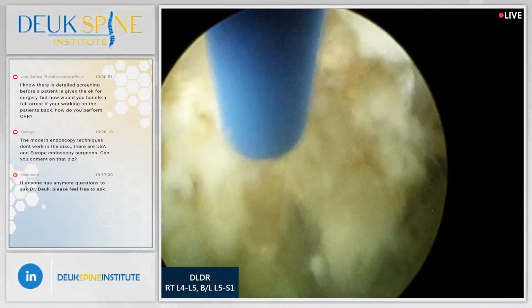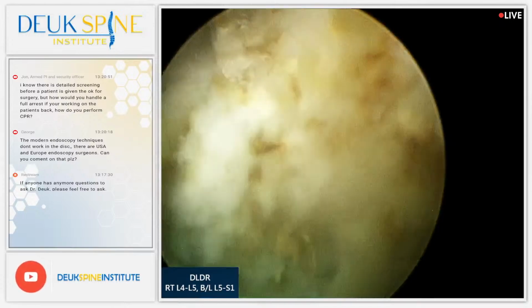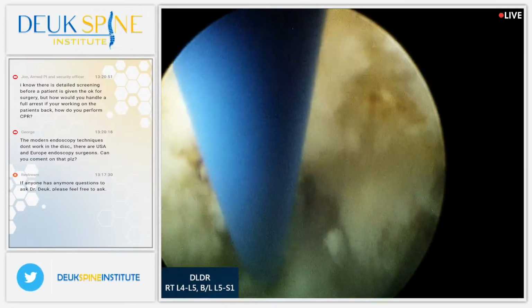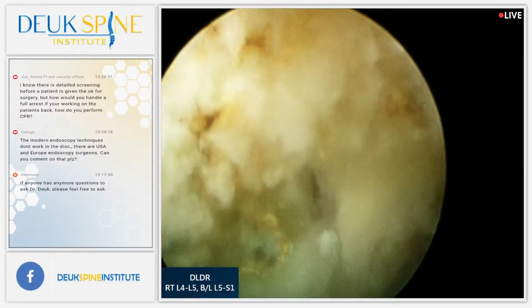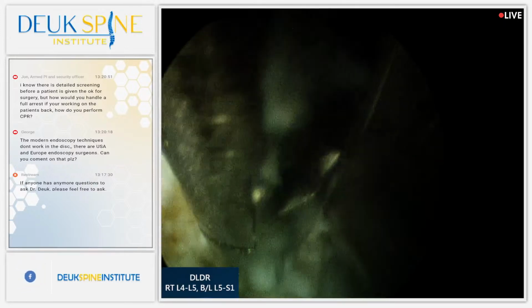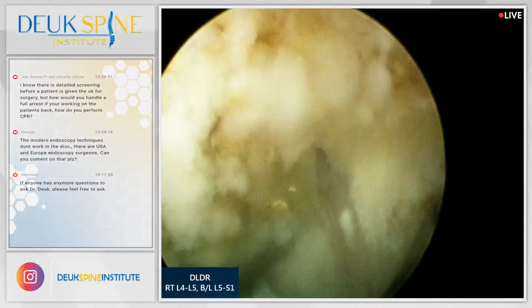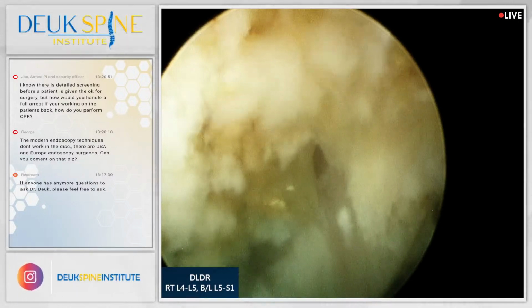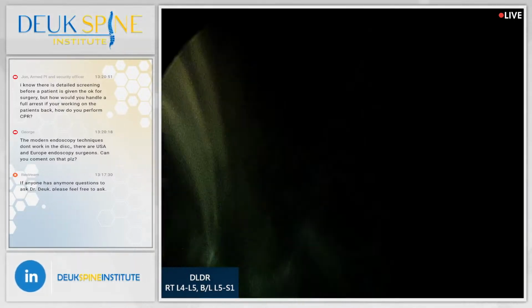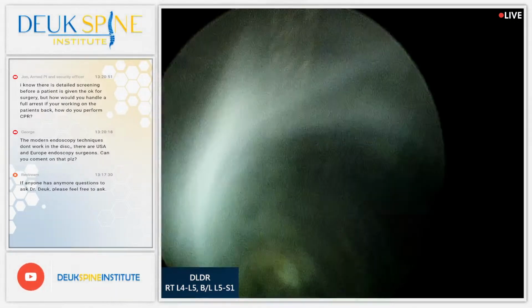Yes. Everything okay? All right, just trying to get this last bit here. We got one more to go. It's hard to see. Water is coming out the tip. Any other questions? At this moment, no current questions.